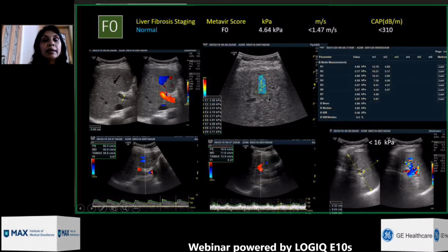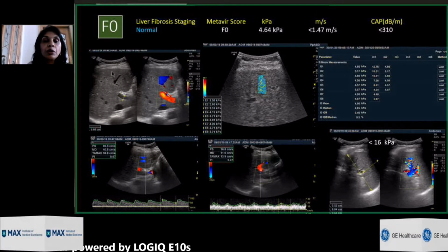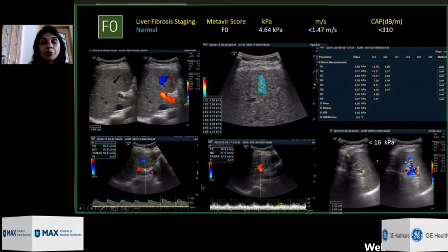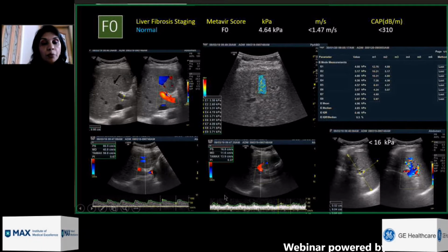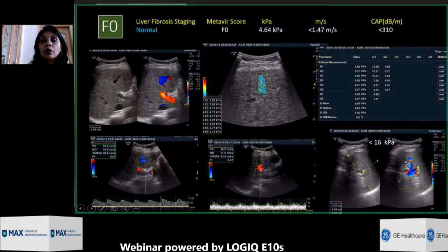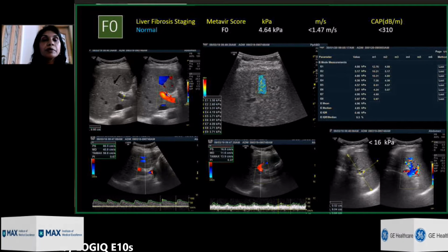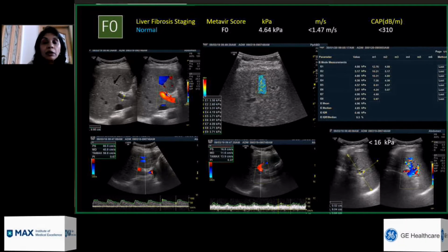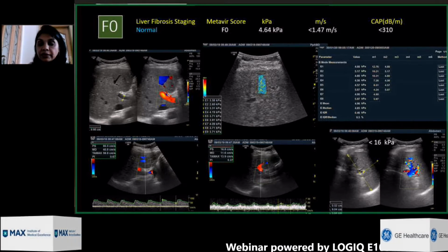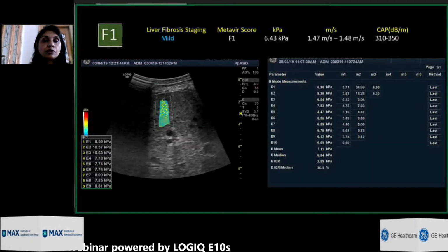It was important for me to put this slide in because along with the elastography, what we are showing here also is the portal vein diameter, the entire color Doppler showing hepatopetal flows, velocities of the hepatic artery, velocities of the portal vein, splenic size, splenic hilum, splenic vein diameter, along with that there are no collaterals. So this just raises the degree of confidence that we can give along with the elastography. It's entirely individual preference whether you would want to incorporate this or not. But this is how shear wave elastography works wonders along with the ultrasound.